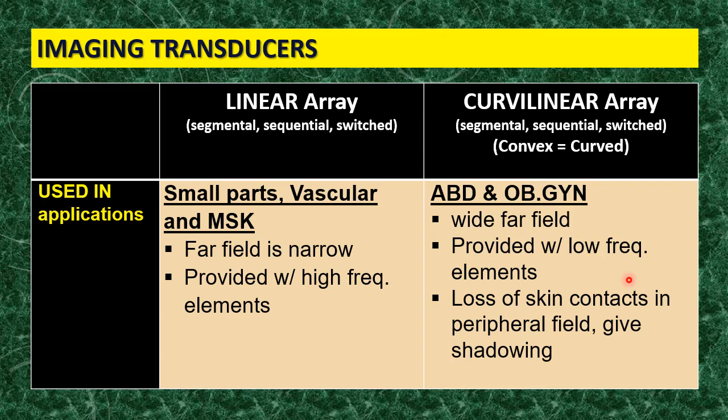you must see some defect, lack of image, right? Because of what? There is a lack of skin contact. So this is one of the side effects or the drawbacks of this probe, that you might lose skin contact in the peripheral field.